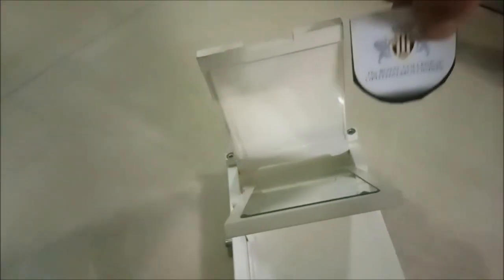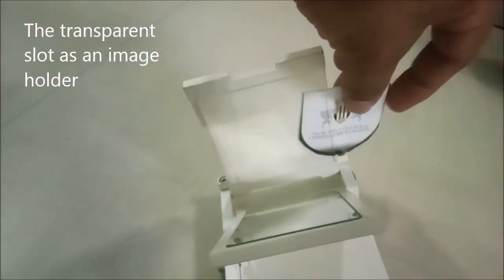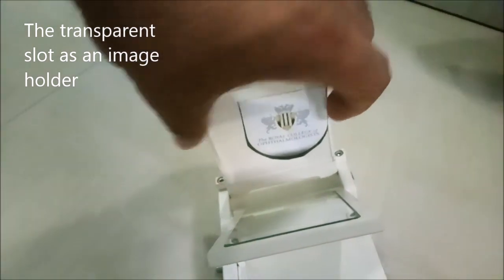A slot has been created to slide the desired picture, which stays and is projected by the mirror to be traced on the paper with the help of the other eye.